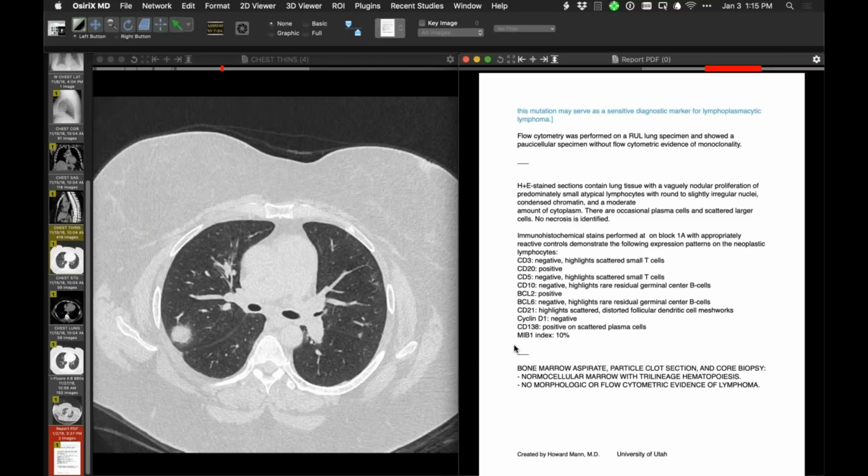I describe the presence of the opacity. And then I do often say that it should be reevaluated on follow-up examination, and sometimes I put 4 weeks or 8 weeks, for example. So I'm very circumspect about encouraging a diagnosis of pneumonia when the only thing I know about the patient is, for example, just a cough. And that's commonly what I do see at the clinic. So that sort of answers your question, but not entirely, I know.